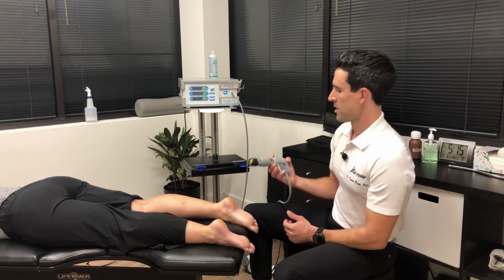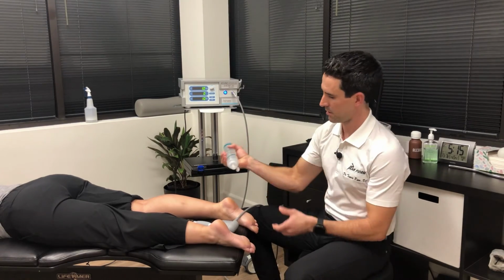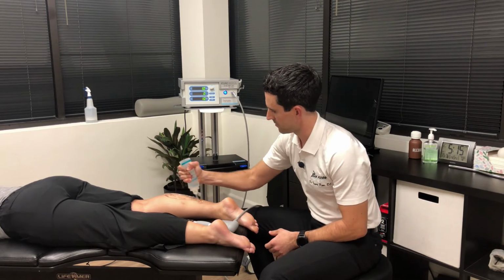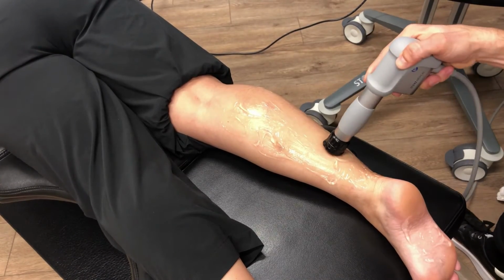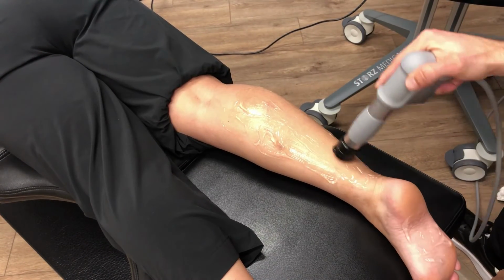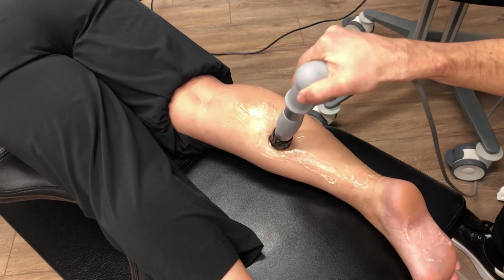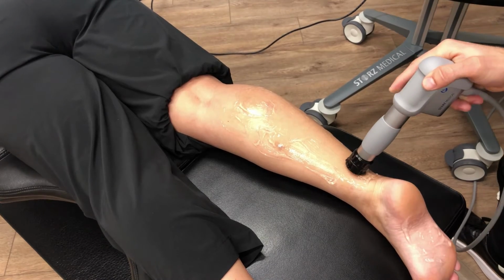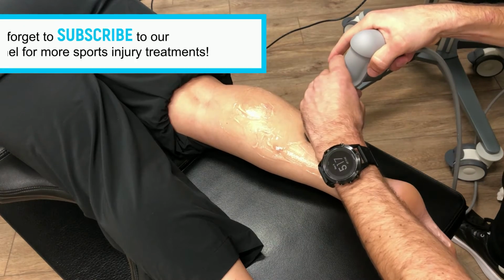So we're going to start by using some ultrasound gel here, and we're going to put it all onto the muscles we're going to treat. Okay, so we're going to start the therapy here, work the calf musculature first down towards the Achilles and hit all the muscles, the trigger points that we found in the tissues, and then we're going to work into the bottom of the foot and get into that plantar fascia a little bit more specifically. All right, ready, Sarah? Okay.